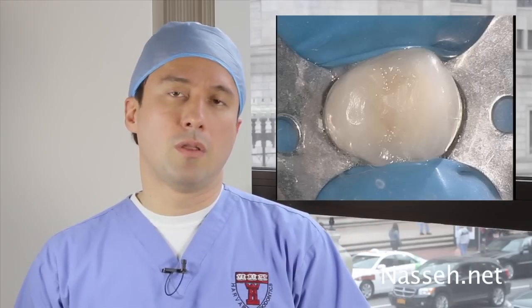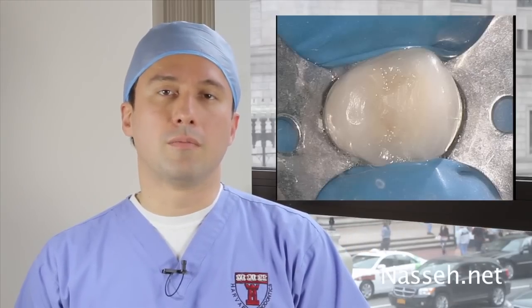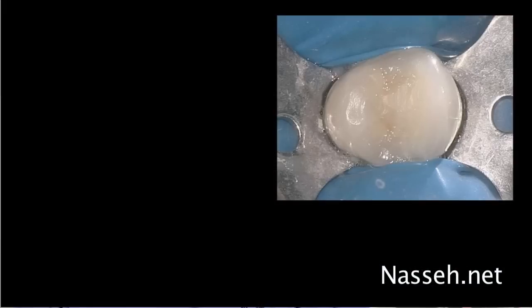Removal of the existing crown for the retreatment would be ideal as it allows easier access to the silver point. But since a provisional crown was not readily available, we elected to retreat the silver point through the crown, although it is more difficult access-wise and would require high magnification and illumination as well as microsurgical techniques.